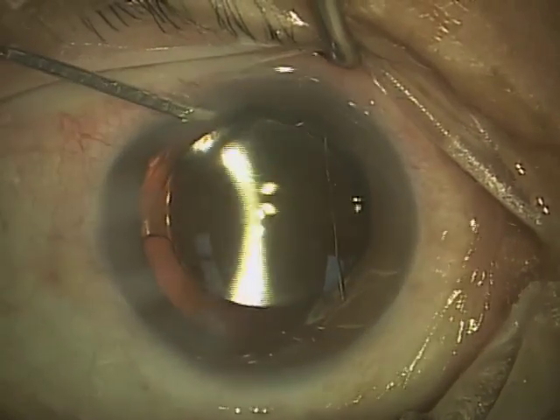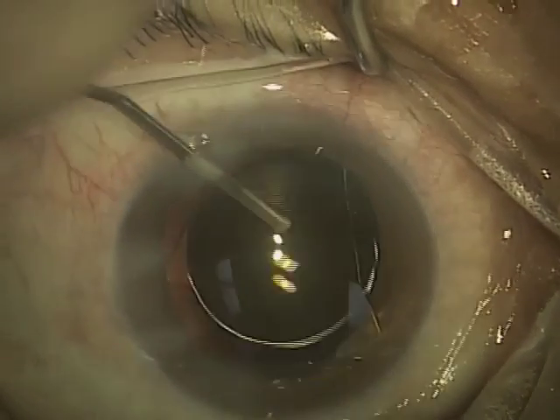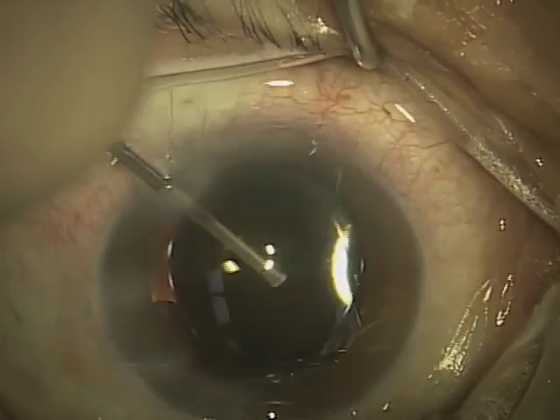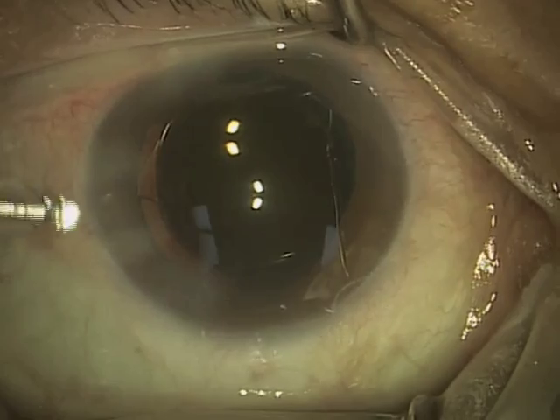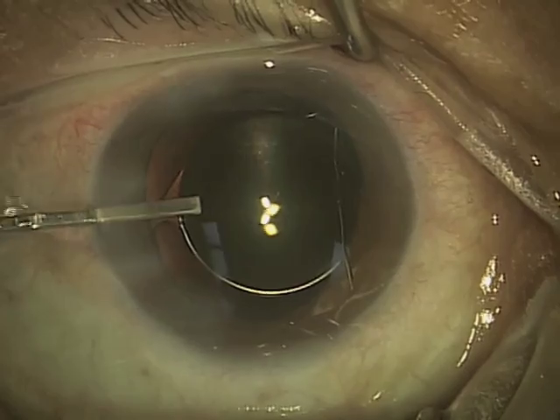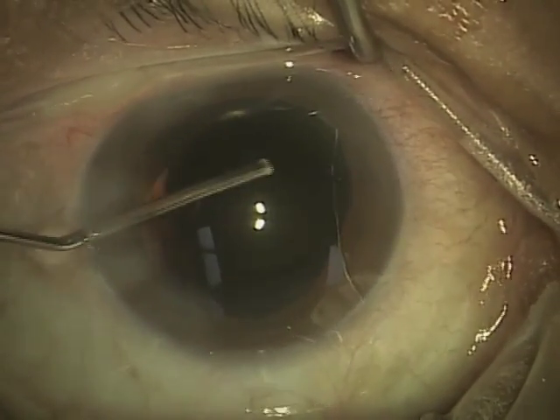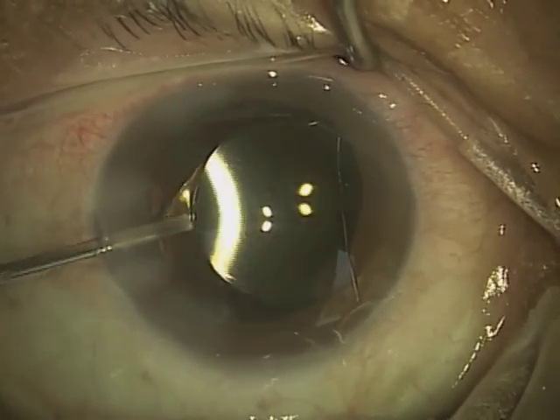Now what I'm doing is hydrating — basically using pressurized saline solution to close off the little paracentesis or side incisions that were made with the one millimeter diamond blade earlier. I'm injecting some special saline solution into the eye itself, making sure that the lens is well centered and in a good position.